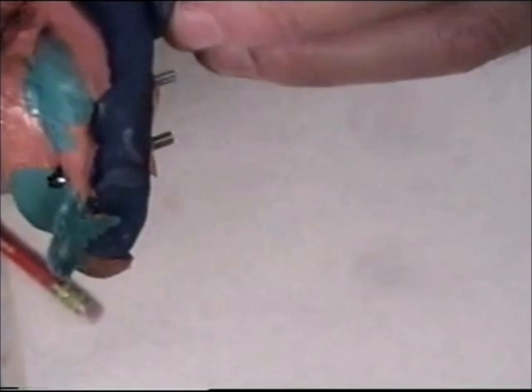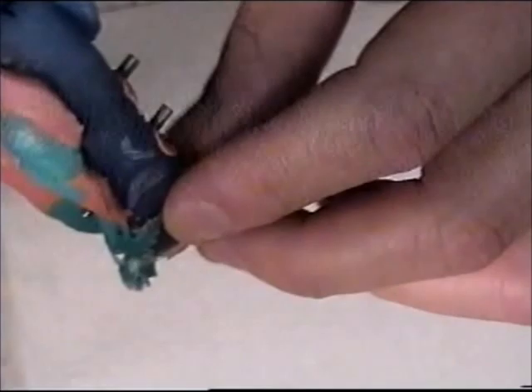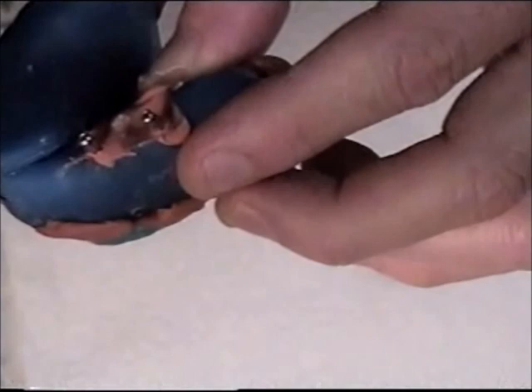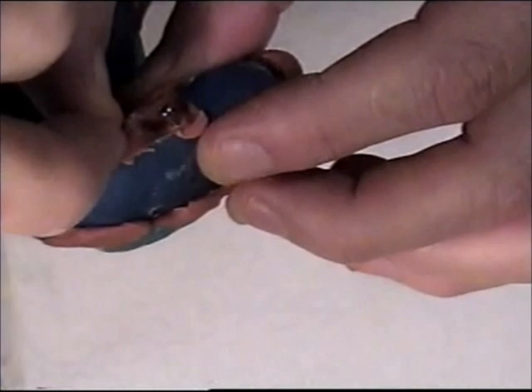The implants were in the mouth, and the doctor needed to make an impression using these pickup copings that are in the impression here. And with these pins, he screwed the pickup copings into each one of the implant bases. Then he took the tray, put his material in the tray, and took an impression of the mouth with the pickup copings screwed into the implant bases. After the material is set up and he's ready to pull the impression, he unscrews the guide pins, and then he lifts the impression off, and he has the pickup copings remaining in the impression.